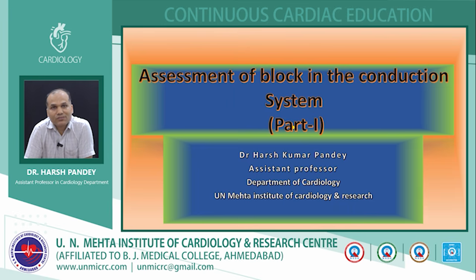So today I'm going to discuss the assessment of block in the conduction system, and this is the first part of this lecture series. Assessment of the block in the conduction system does not mean just recognizing the block in the ECG. We have to accurately localize the block in the conduction system so that we can plan the patient, whether the patient needs medical management or a pacemaker.